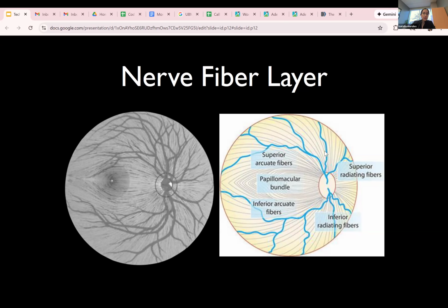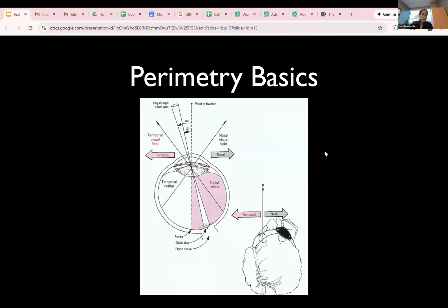And then, along those lines, neurologic visual fields tend to respect the vertical meridian. We'll show you some examples of what that should look like if you're concerned for something that's not related to the eye, but maybe posterior to the eye, in the posterior aspect of the visual pathway. Those tend to respect a vertical meridian. And so that would make you more concerned: hey, this is not glaucoma. Maybe it's something else that's causing these visual field changes. So keep going here.